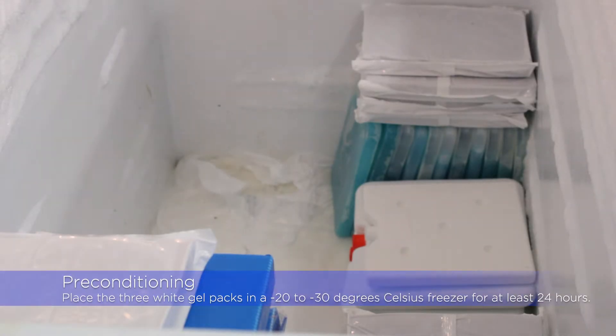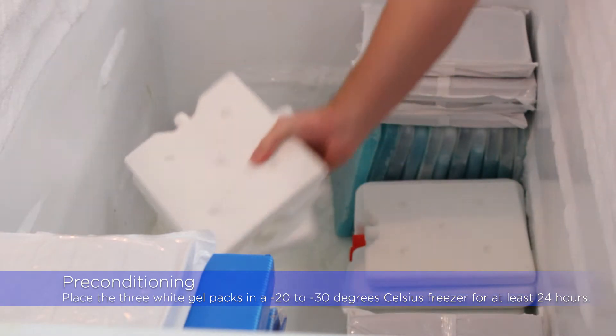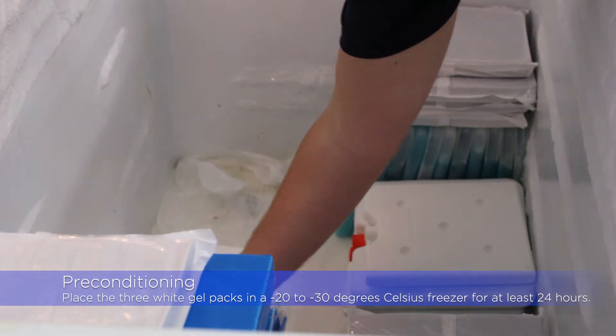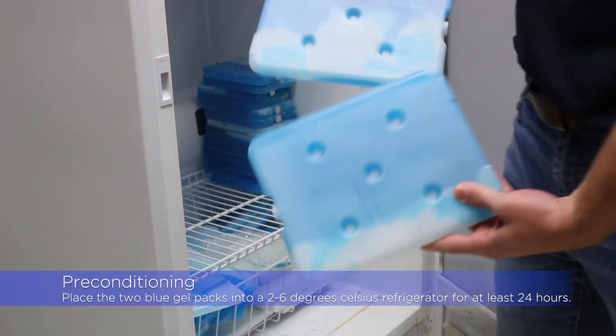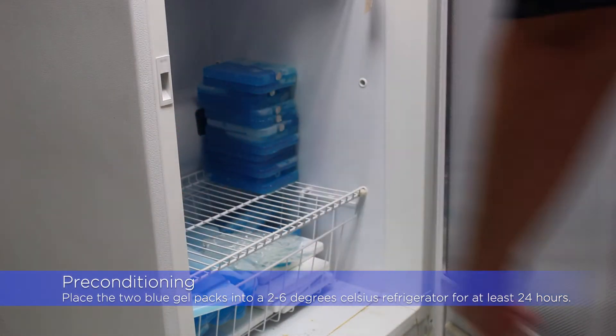Before packing out your cooler, you will first pre-condition the gel packs for a minimum of 24 hours. You will need to place three white VP0P gel packs in a freezer between negative 20 and negative 30 degrees Celsius, and two S6 gel packs in a refrigerator between 2 to 6 degrees Celsius.